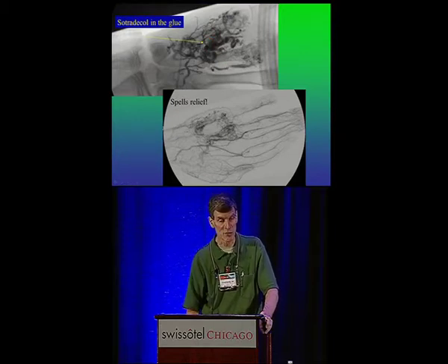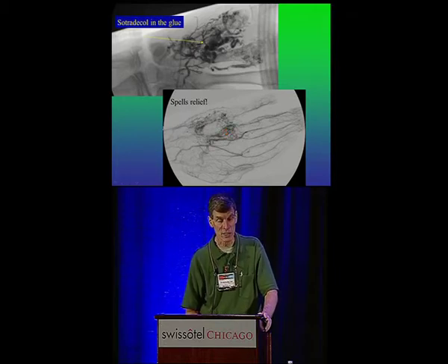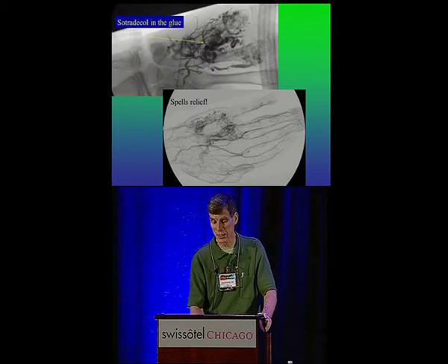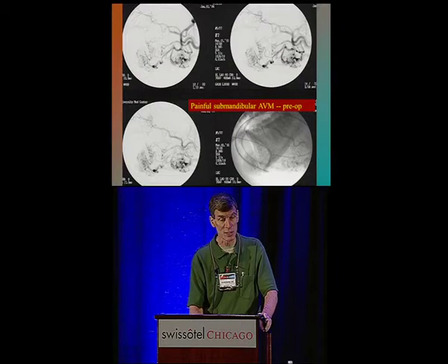And when you did the final angiogram after we let the cuffs down about 10 to 15 minutes later, and you have to have kids under general anesthesia to do this kind of stuff, you can see that that area now is completely non-filling because of the sclerotherapy that was allowed to sit in there for 10 minutes with a suprasystemic cuff up, and arteries are in good shape. Onyx and the related compounds, I think, are going to work well.